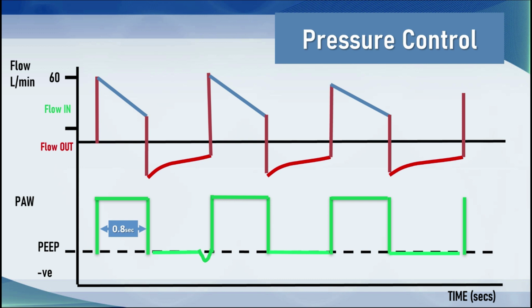If the respiratory rate was 20 breaths per minute, the I to E ratio was 1:2, then we have a 2 second expiratory time. But that was causing auto PEEP. If we reduce the rate to 15 breaths per minute, that is a 4 second cycle and a 1:3 ratio, there is 3 seconds for expiration, and that might just work. If the rate dropped to 10 and then the ratio was 1:5, you've got 5 seconds in expiration, and that should be plenty. If this proves inadequate to control PaCO2, consideration should be given to increasing the inspiratory pressure.